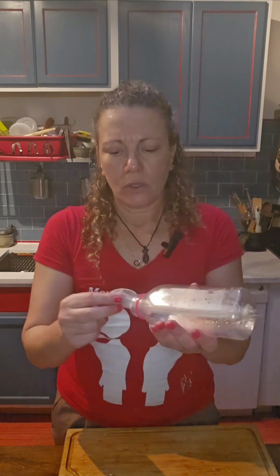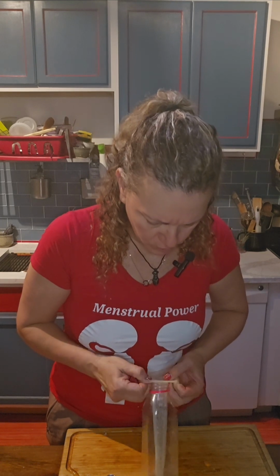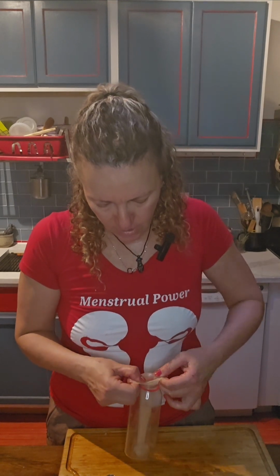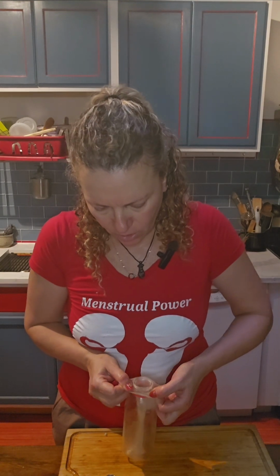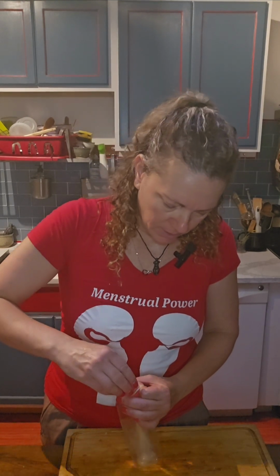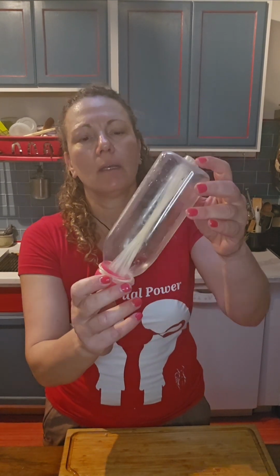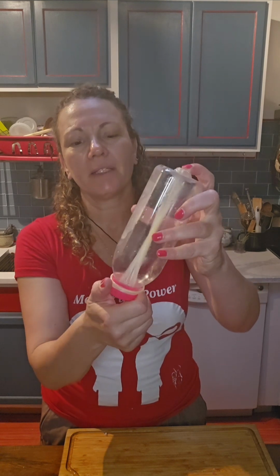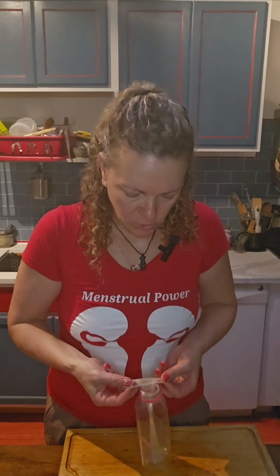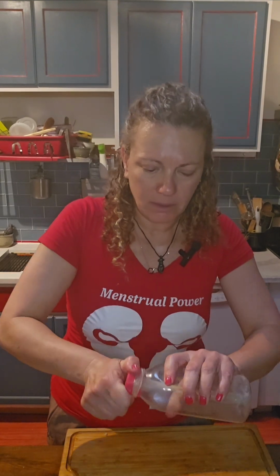Okay, so now you take the condom, you stretch it, don't put too much force, because we don't want to test the ability of this to hold, and I'm turning it a little bit clockwise, because when I screw the cup back, it will turn it back. So this way, you see I did it the wrong way, so I will unscrew, and then once again, I'm stretching it, holding it on the body, on the bottle.